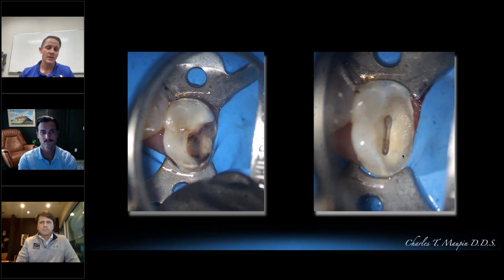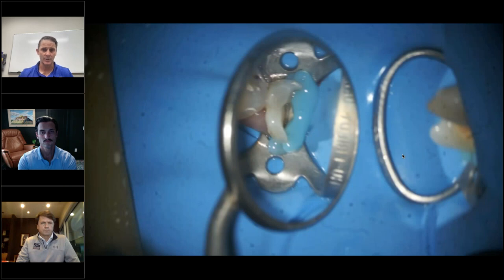So I think what I heard from the last one, from those that were not able to attend, is that these videos really help to drive home the technique, and being able to visualize it made it easier to go back and employ tomorrow in the operatory when you're there. So the image on the left is before any treatment was done. You can see the caries there. The image on the right is after cleaning the caries up and access into the canal, and you can see the liquefactive necrosis going on there. Immediately after this step, we went in and did the coronal conditioning, and that's what you're going to see in this video here.